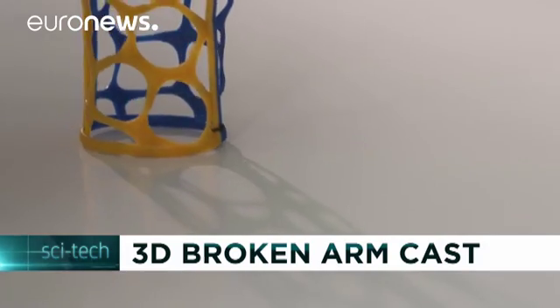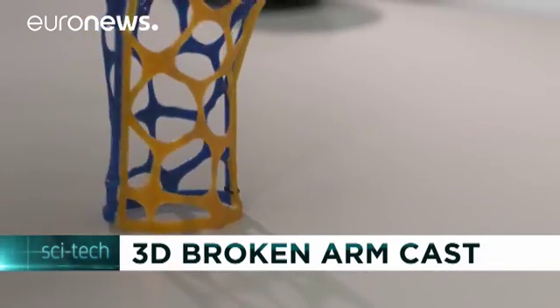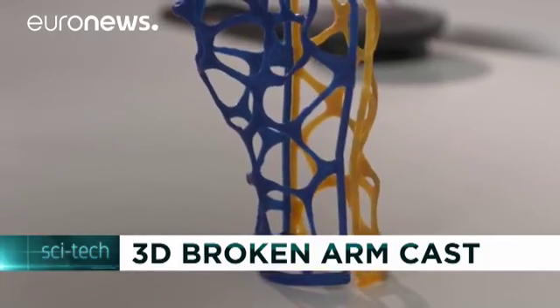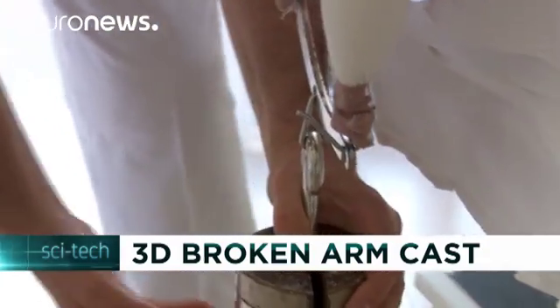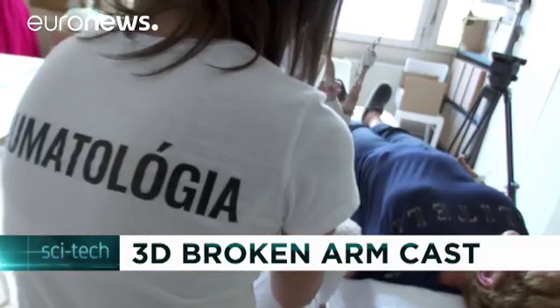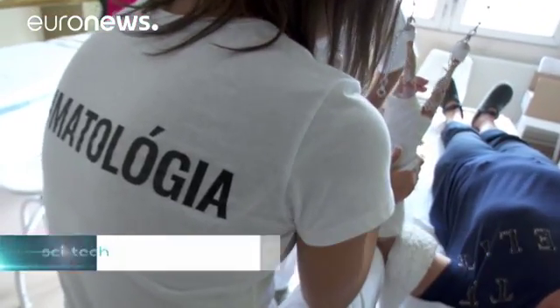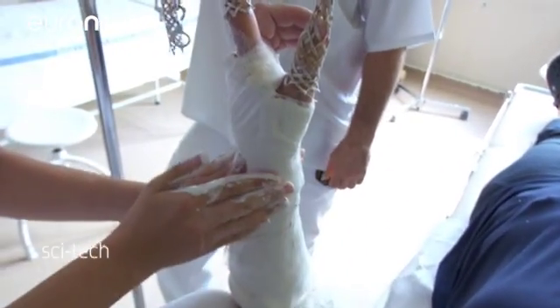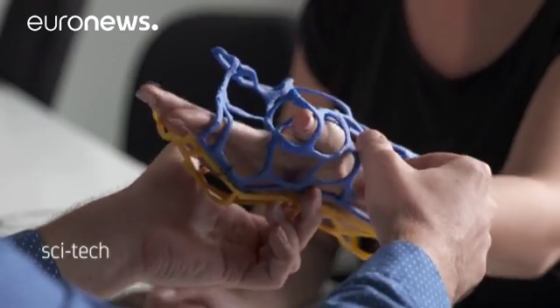If you've ever had to wear a cast, you'll be familiar with the discomfort of not being able to scratch that itch on your leg or arm. This might be the answer. In contrast to a traditional plaster cast which doesn't allow your skin to breathe and is relatively heavy, the new 3D printed cast is made entirely of biodegradable plastic. It is airy and light.